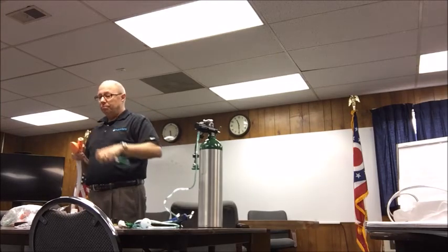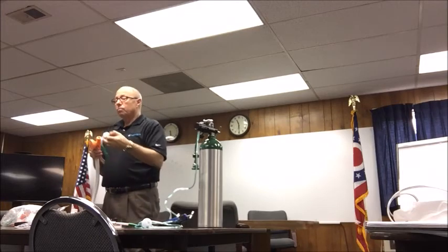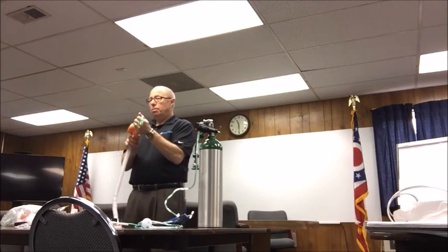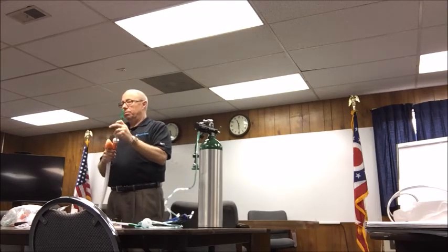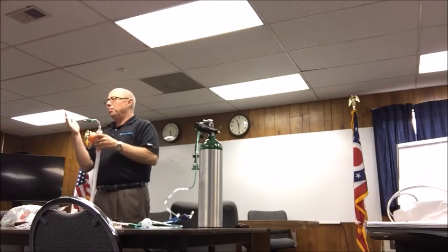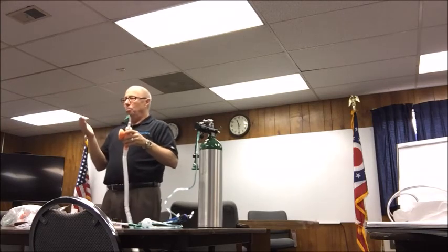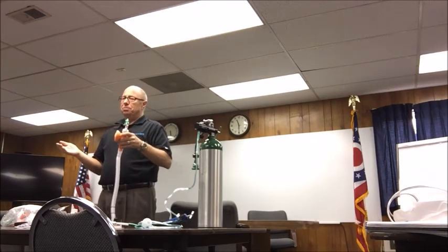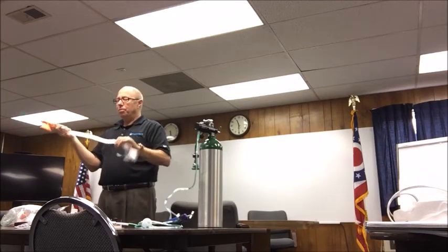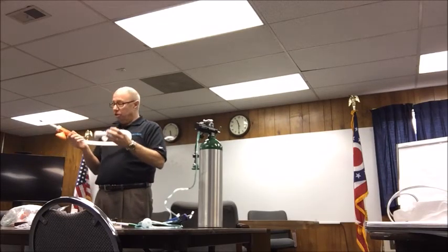I wouldn't even look at it. Just leave the 30 on the regular system, unless you see you're going to need it. But if you knock their drive out, you're going to end up intubating them back in a minute. Yeah, and that's a really good point. As much as I'd like to say this cures everybody, we're going to have to intubate patients. I don't know if y'all are RSI or what, we're going to have to knock them down and intubate them on some patients.